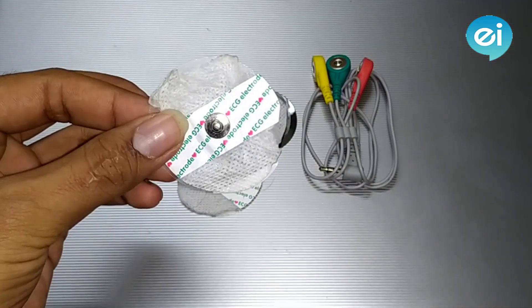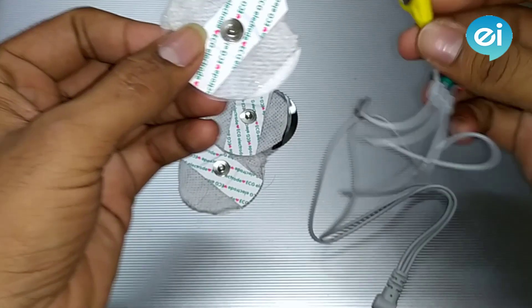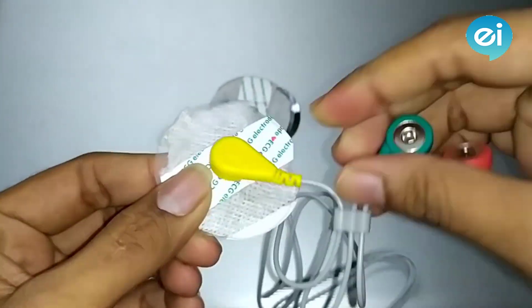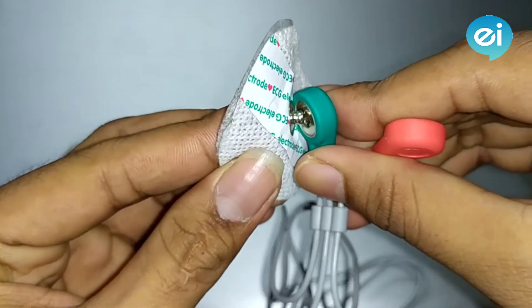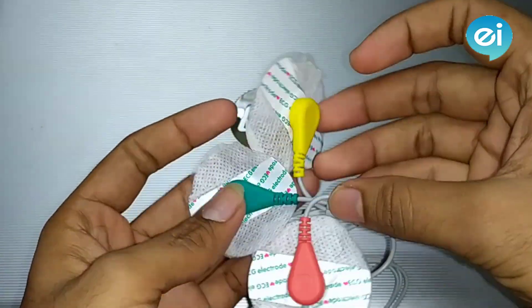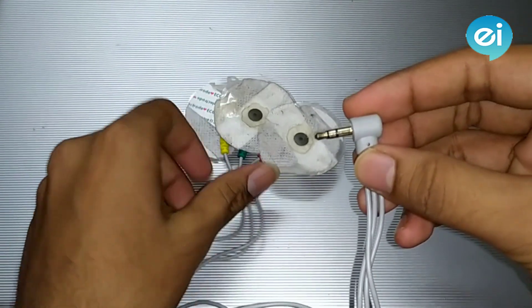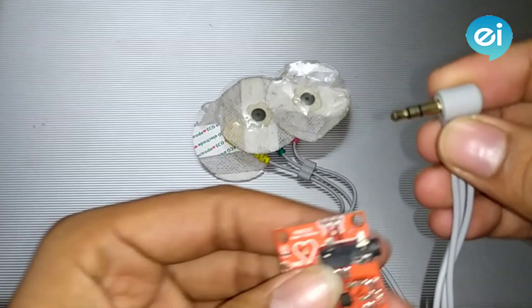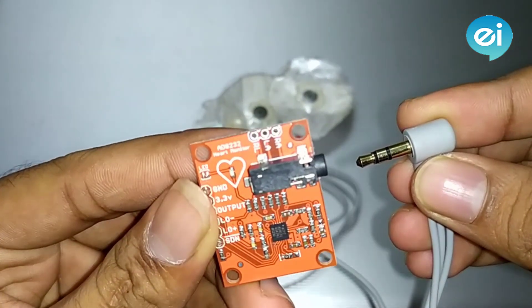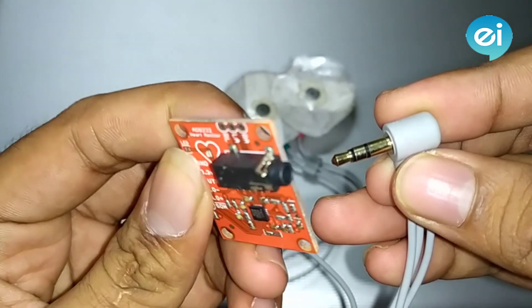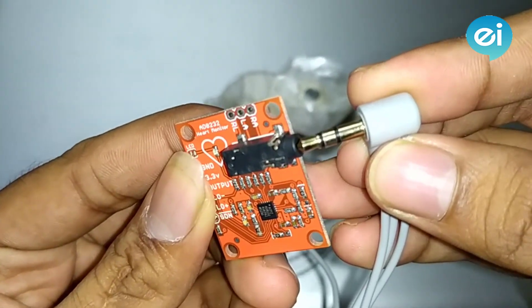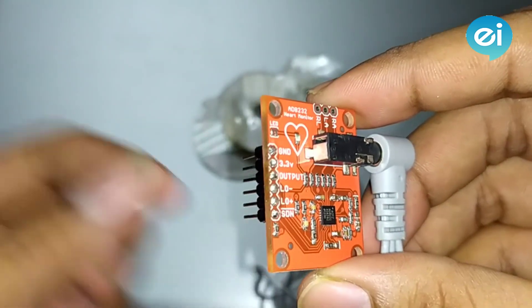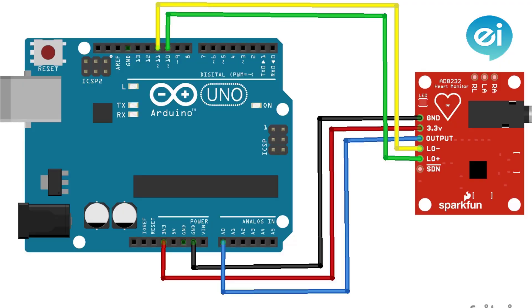Here we have both electrodes and their connectors. We need to make a connection between them. Repeat the same process for all three. On the other hand, we have a 3.5mm jack that needs to interface with the AD8232 breakout board — it has a 3.5mm female jack. Interface it like this. Here we have six pins to interface with the Arduino. Connect the circuit as shown in the diagram.